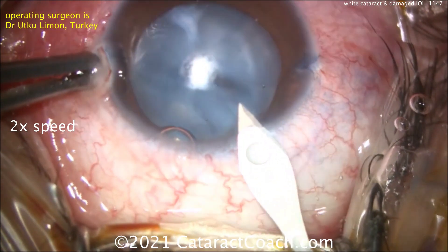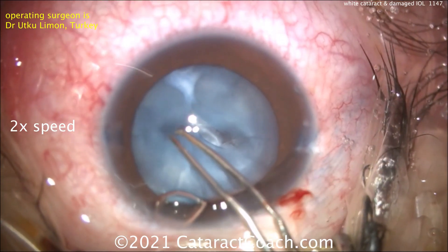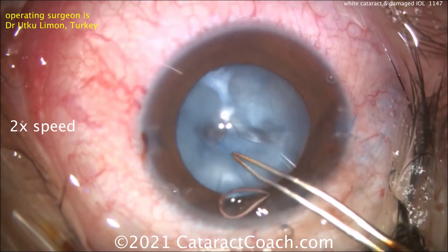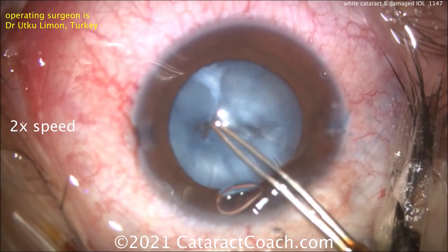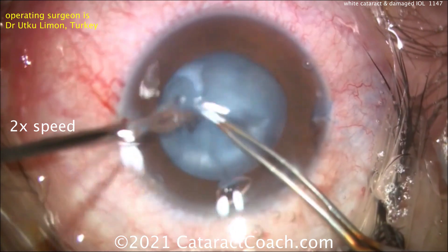Making our main incision now — here we go with the keratome. And now time for the capsulorhexis. This is a fibrotic capsule, so watch what happens: as you start to tear the rhexis, it just gets stuck. How do you continue it? He's trying to free it but it's totally stuck.